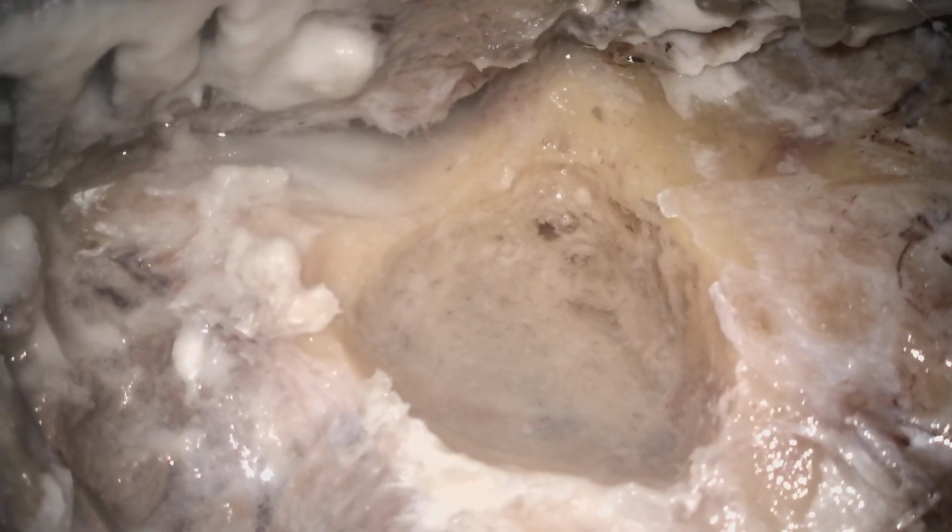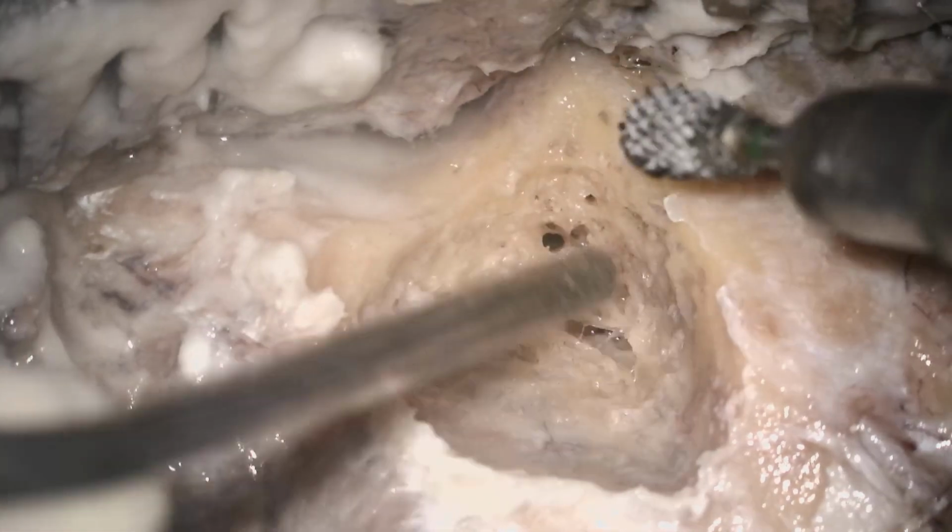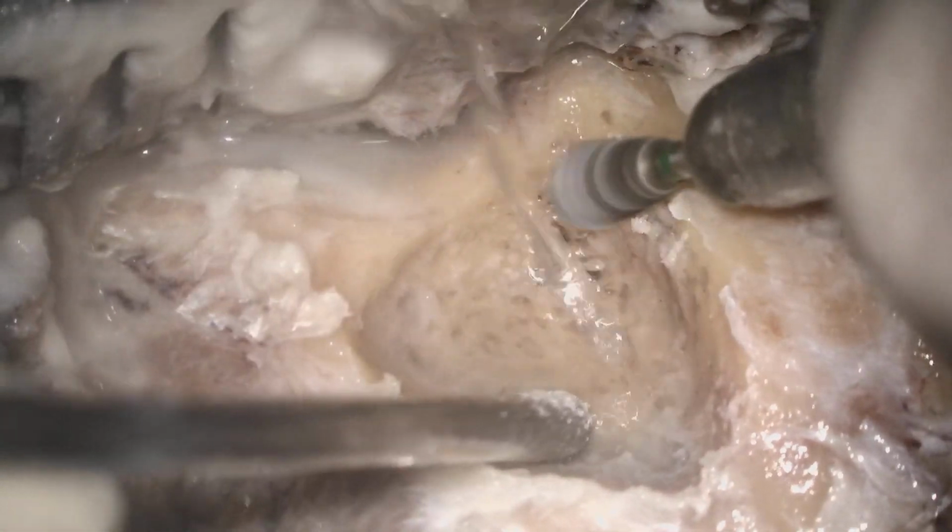The suction is a very difficult thing in cortical mastoidectomy sometimes. If you have a blocked suction apparatus, then it is very time consuming. Okay, now give a wash.